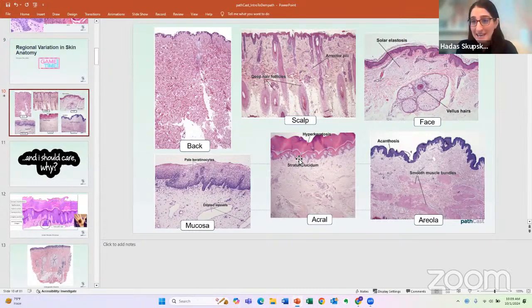For example, as we look at melanocytic neoplasms, it makes a big difference where you are. If I'm on the palm or sole and they're biopsying to rule out a pigmented lesion, I'm going to have a very different set of parameters, looking at the melanocytic architecture and cytomorphology in special sites, like acral nevi and acral melanoma, versus other skin sites. So immediately recognizing where you are and shifting your brain, which direction am I going to go, whether it's inflammatory or neoplastic, but keep doing that top-down approach. Looking at each and every layer will help you identify where on the body you are. And again, I think that's a fun and useful exercise to do blinded when you're looking at a slide. Right, thanks.